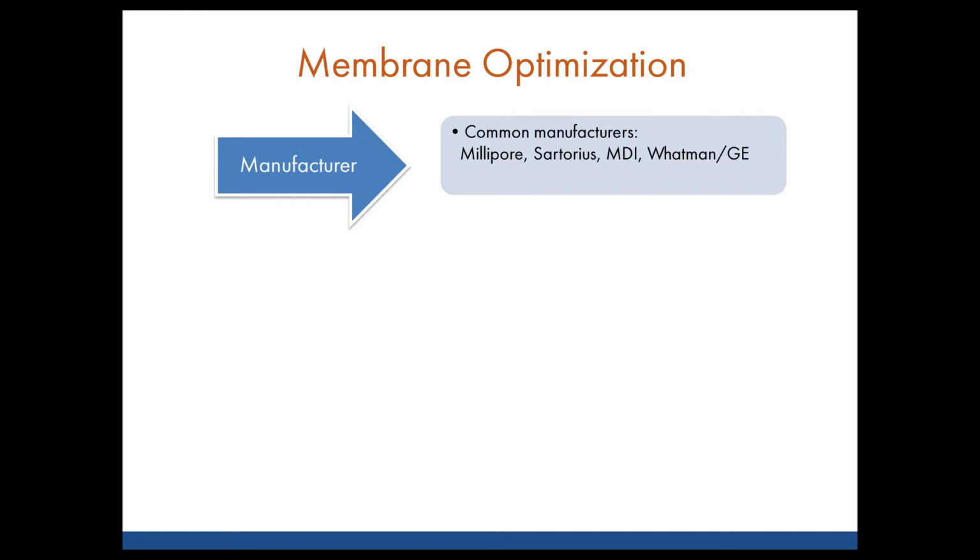Here we have outlined some of the main areas to consider when choosing the correct membrane. First of all, you need to consider the various manufacturers of membranes that are available. Manufacturers treat their membranes with proprietary components that make them hydrophilic and able to bind to protein. This gives them different properties and makes them more suitable than others for particular assays. So again, these need to be screened empirically for every test. What worked well for one assay might not work well for another.